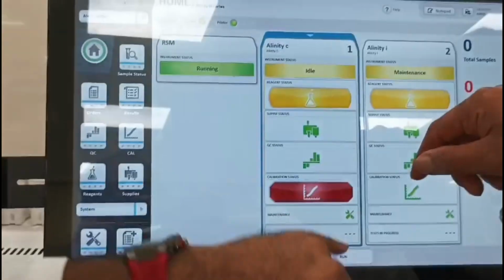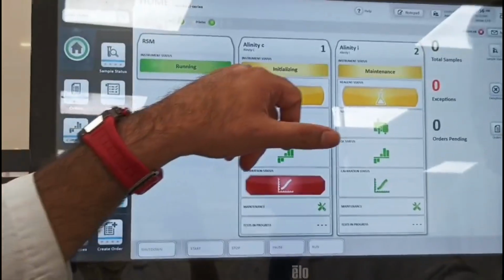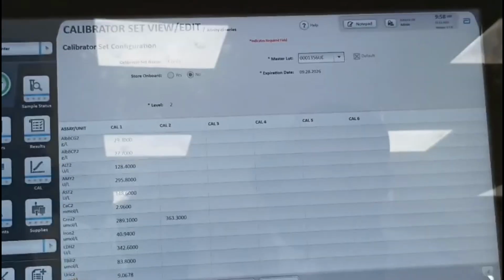The machine automatically takes it, but inside is no need. Saline is there. Then run. Now after 2 or 3 minutes, it shows processing or running. You can load. Now you can take it. Calibrate uric acid. All these parameters.